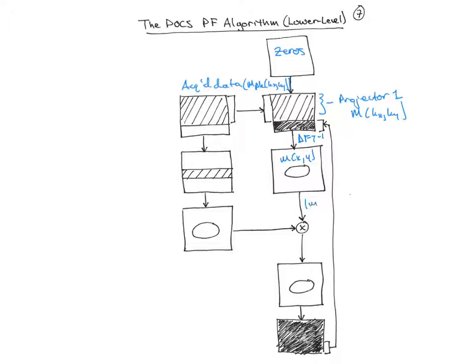Then you take its magnitude to project it onto the set that has the phase from the low-res region. After taking the symmetric data and its inverse discrete Fourier transform, you calculate the low-resolution image for phase correction, and from that you can derive exp of i times angle m sub s of xy.